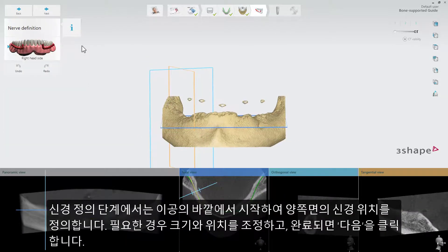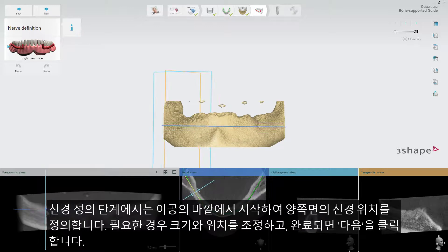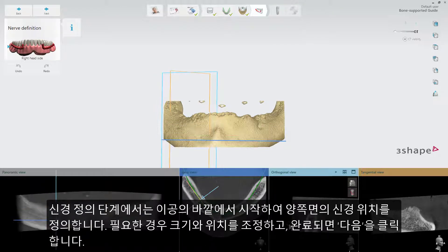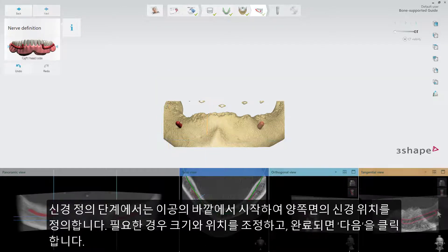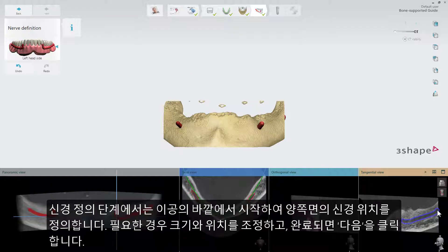In the Nerve Definition step, define the position of the nerves on both sides, starting outside the mental foramen. Adjust their size and positions if needed and click Next when done.